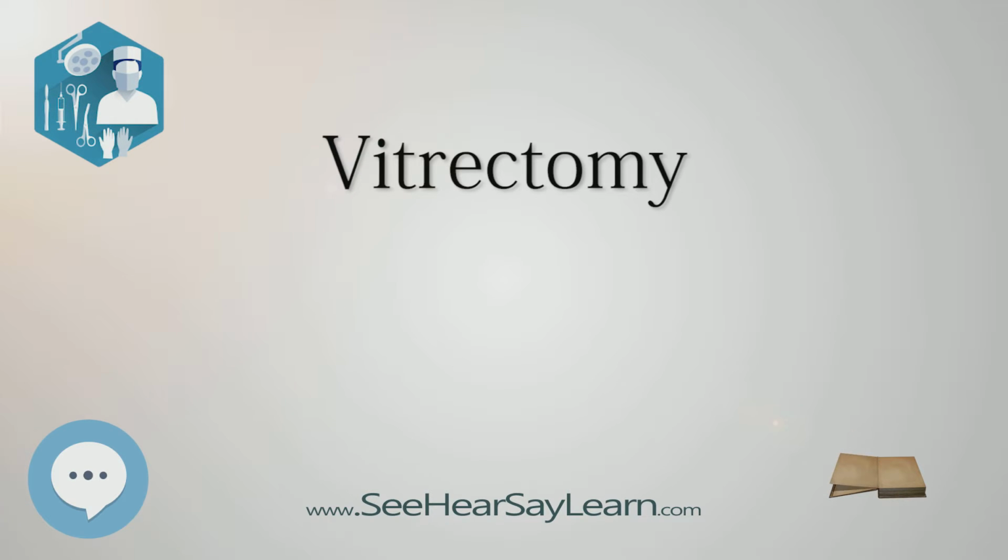Macular pucker, formation of a patch of unhealthy tissue in the central retina, the macula, distorting vision. Also called epiretinal membrane. After vitrectomy to remove the vitreous gel, membranectomy is undertaken to peel away the tissue.